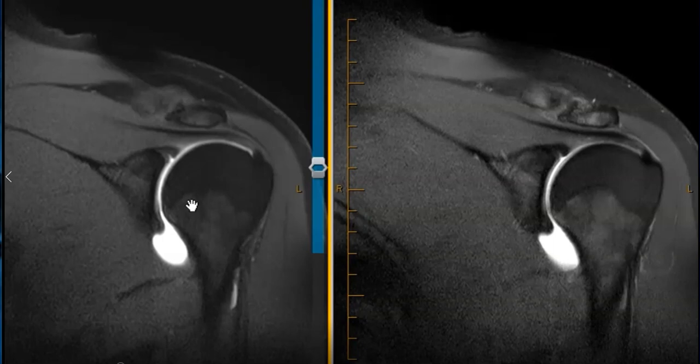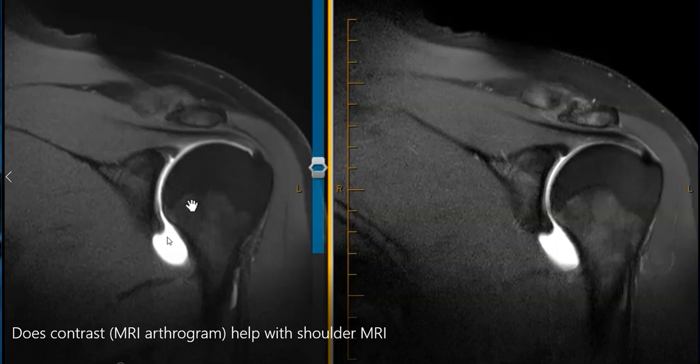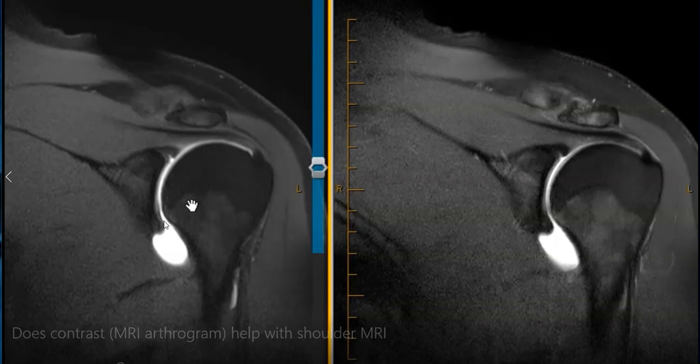This is a view of the shoulder where we see contrast — white — in the shoulder joint, distending the joint with contrast. We see the bone here; this round ball is the humeral head, this is the glenoid, and we see the white fluid here, light bulb bright, filling the shoulder joint.